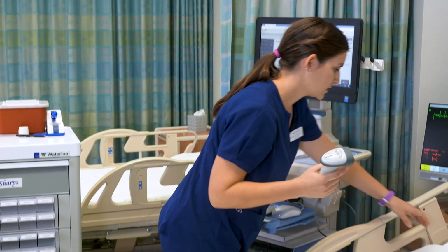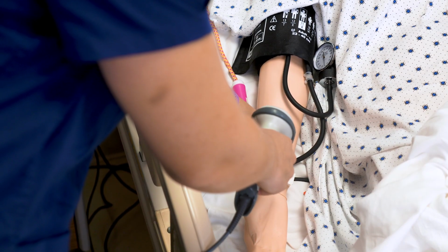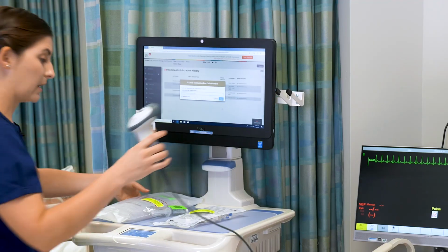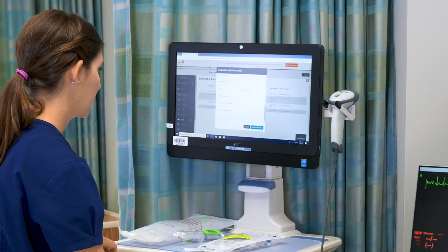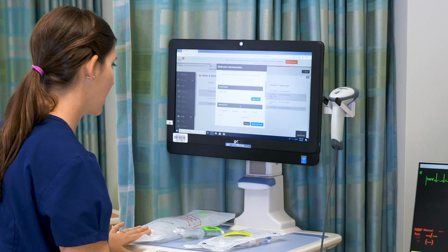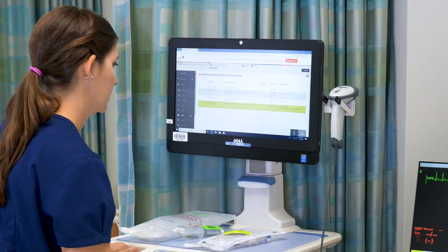Okay, Ms. Duncan, I just need to take a look at your armband here, and can you confirm your name and date of birth for me? Perfect, and I'm just going to scan your band. Now I'm going to scan the medication. And this is going IV, and I confirm that it is at 75 mL per hour, continuous until discontinued.